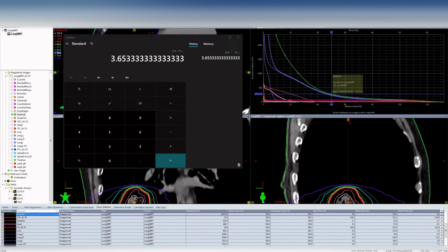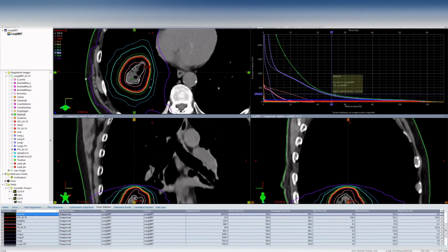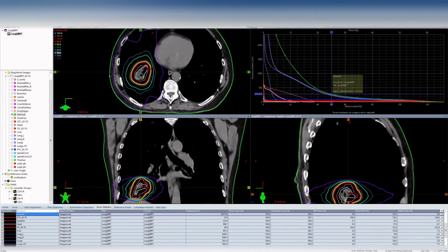And we don't want to have to do this manually every single time. So we just did a rough calculation, and our current value is 3.65, and this is just a test plan that I ran really quickly as an example. After just one run, you might say, okay, now I want to run it again, so I'd make a copy of the plan. Or if you're feeling risky or daring, you might just rerun this plan without making a copy. But probably you would make a copy, run it again, and manually calculate it again. Then you'd have two plans, and you would go back and forth until you get a plan that you're happy with, right?